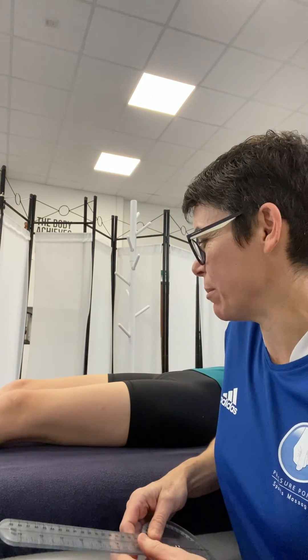This is how to assess range of movement of the hip joint. We're looking at two types of flexion: leg straight and leg bent, knee bent.